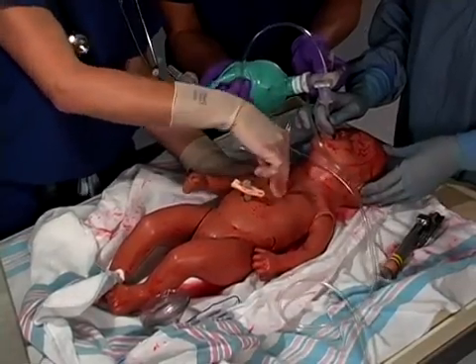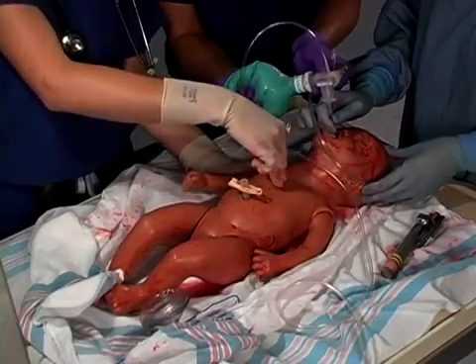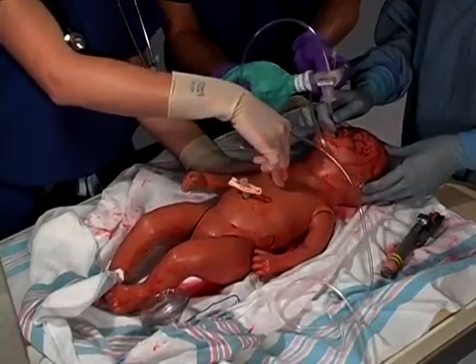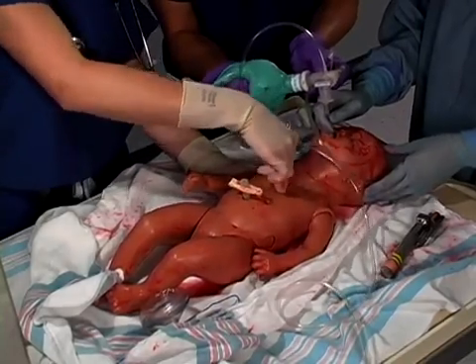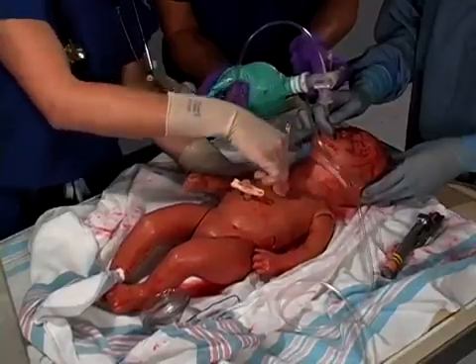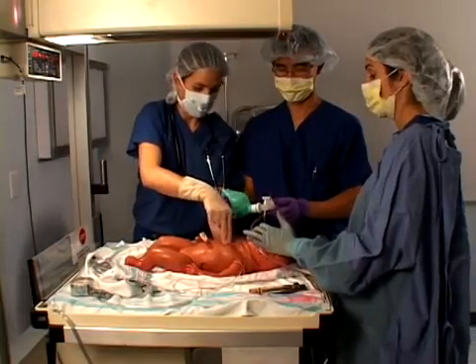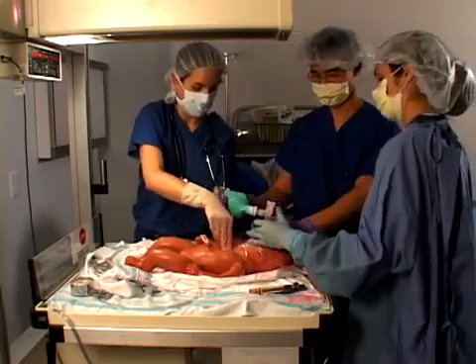When the heart rate remains below 60 beats per minute, despite 30 seconds of assisted ventilation, followed by another 30 seconds of coordinated chest compressions and ventilations, epinephrine should be given by umbilical vein. Okay, Dr. Lee, I think we're going to need to put in a UVC. So if you would take over holding it, and get that ready.